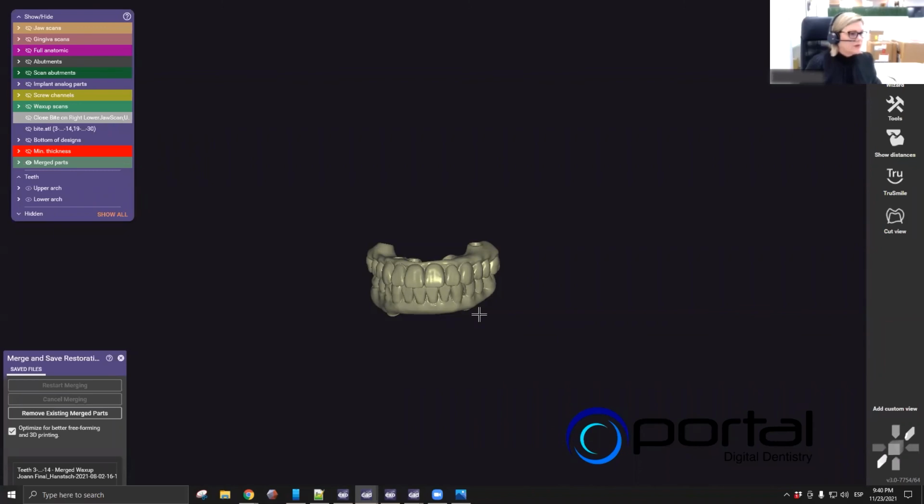Daniel, that was really great, especially the last part of the webinar in relation to same-day full arch implant restorations and possibilities. I know this is a workflow that would be really interesting for us to take more of a deep dive on.